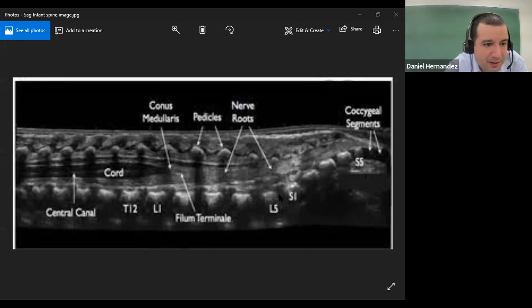The L5-S1 junction is where you get this bending, so that you see the sacral segments tailing more posterior. And this is that lumbosacral junction. That can potentially be a landmark where you see the bending back. So then you get L5, L4, L3, L2, L1.